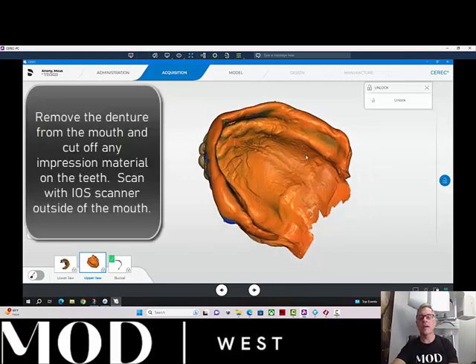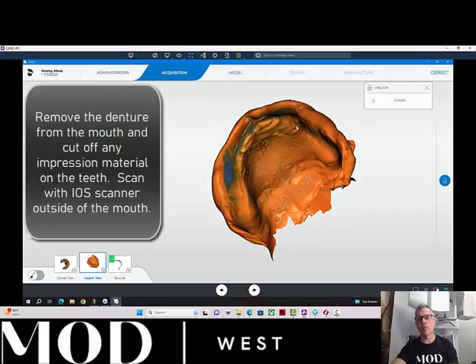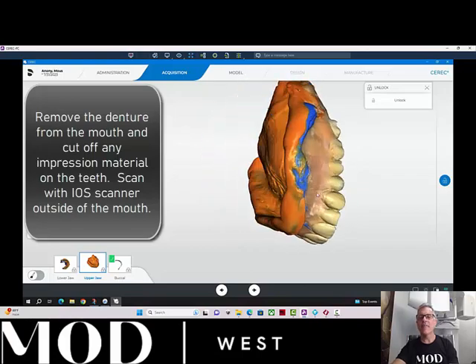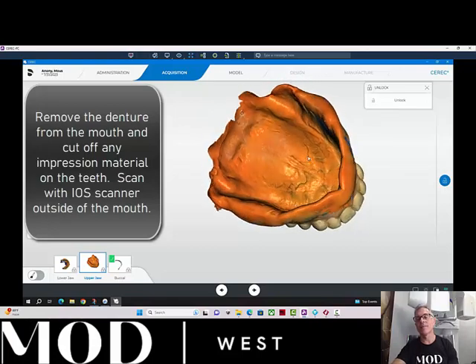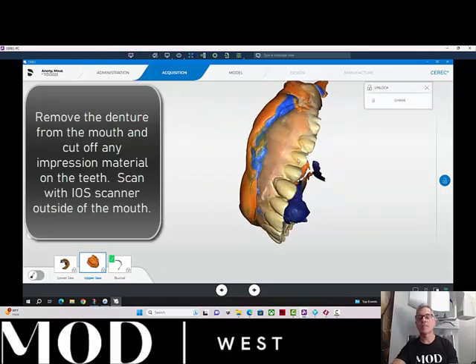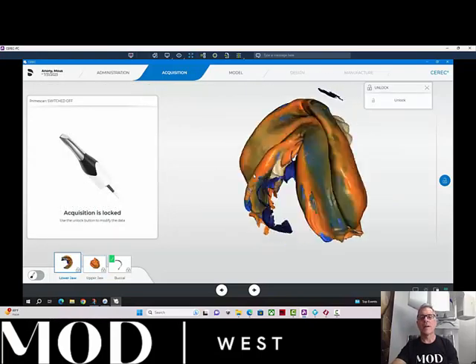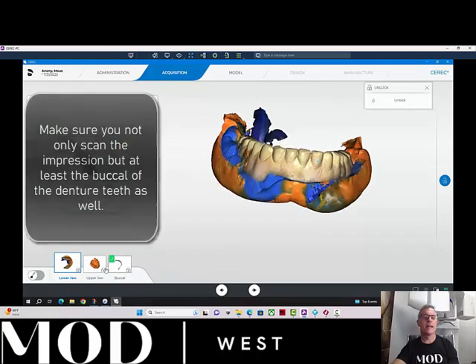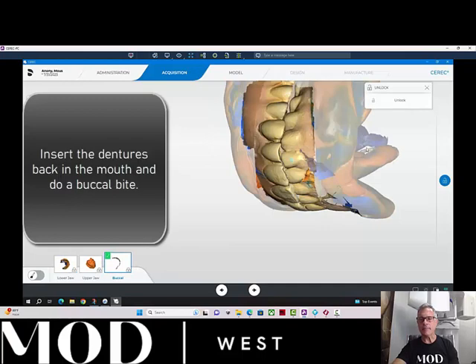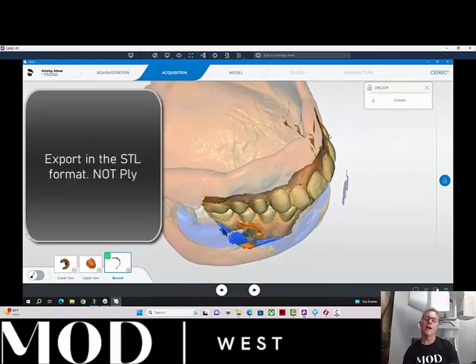So here we have the patient's upper. I use Take One by Kerr, did my border molding, did the wash, and I scanned that. I scanned not only the inside — the intaglio — of the impression, but also the patient's teeth. I did that on the upper and also on the lower, and I got the patient's teeth and did a buccal bite. Now we're going to export these files as STL files.